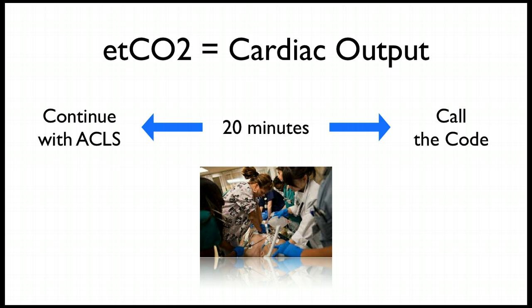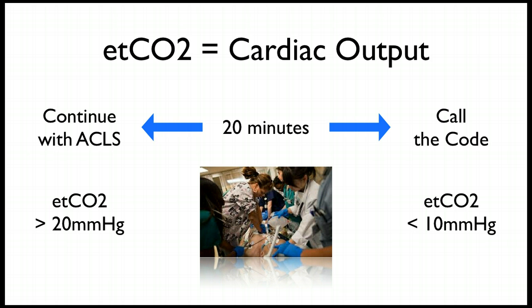This is where I think end-tidal CO2 in cardiac arrest has the most bang for its buck. Multiple papers and researchers have shown that after 20 minutes, a CO2 level typically around 20 or better has a better chance of ROSC, whereas a level below 10 essentially has none.